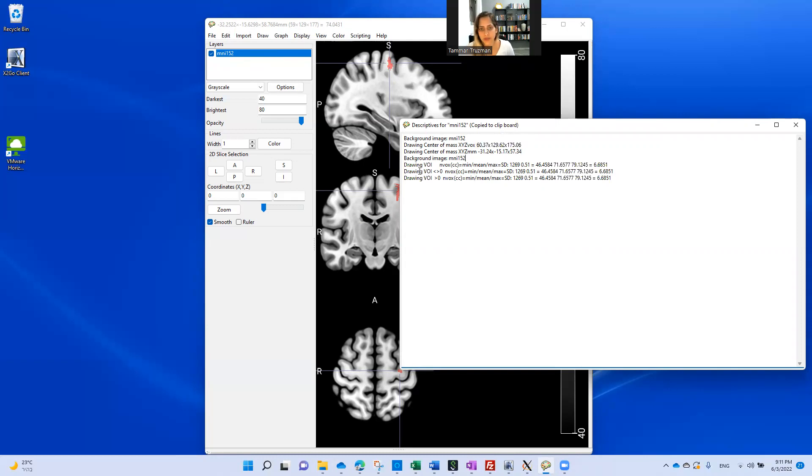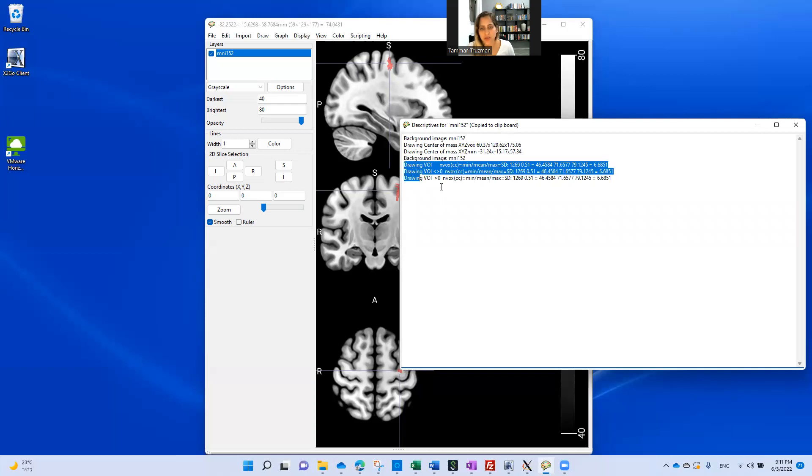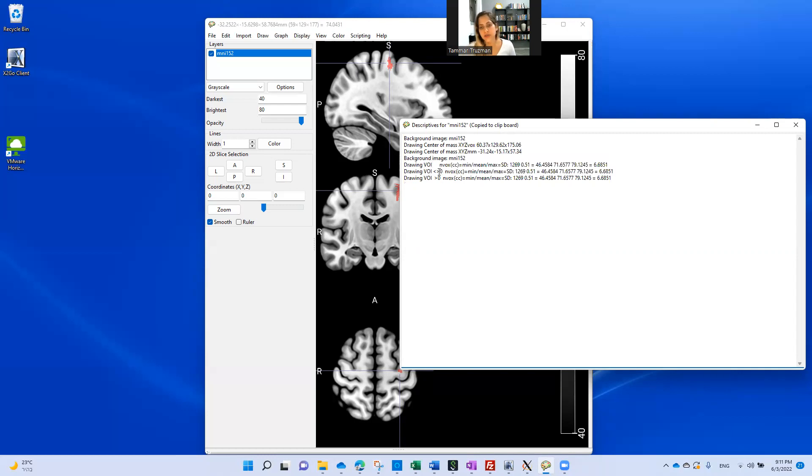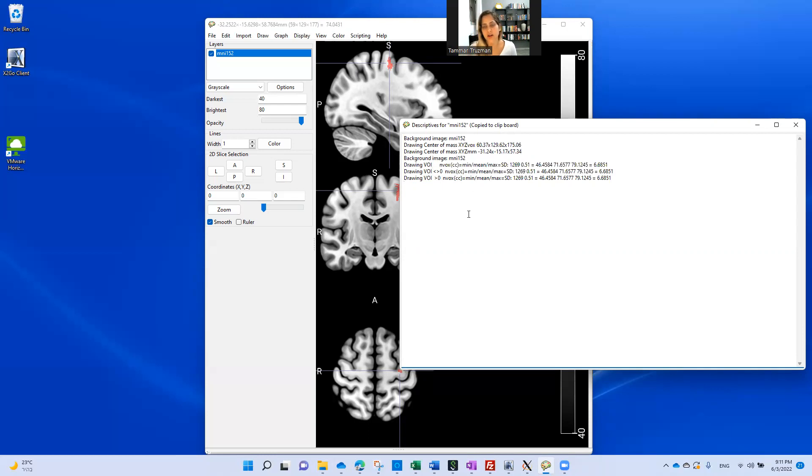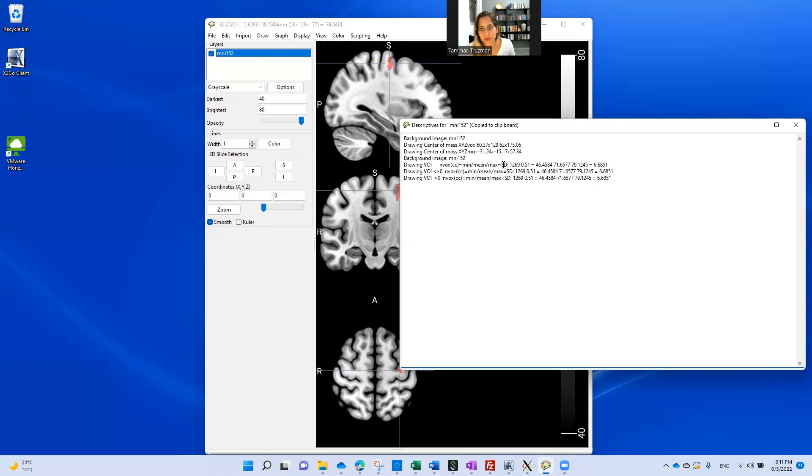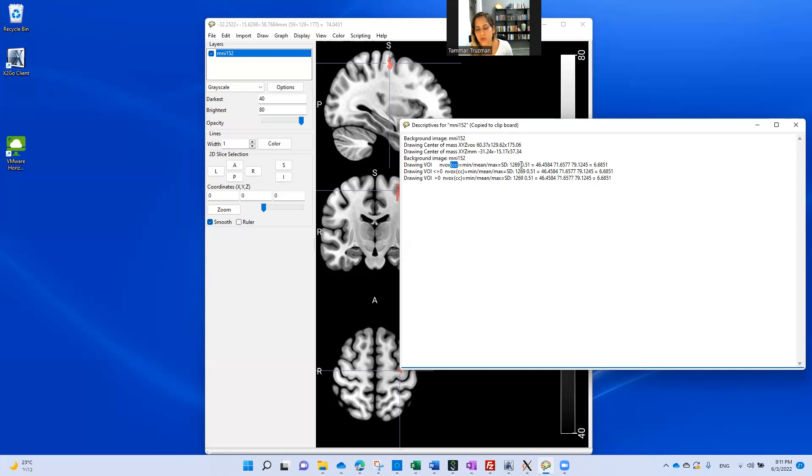Now I have more values here and they are in three rows. The three rows are related to all the voxels in my VOI. The second row is all the voxels that are different than zero and all the voxels that are positive, greater than zero. Why do I need this? If I have masks, I want to know how many voxels from the lesions are overlapped with real voxels or voxels that do not have the value of zero, let's say outside the brain. In my case, when I overlaying on the background image of the MNI standardized 152 template, I can see that all my voxels are positive and greater than zero.